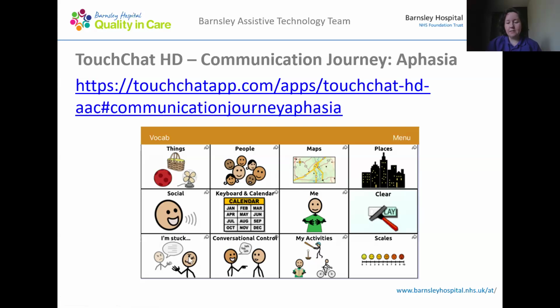And then it goes, is it a person or is it a place, etc. It's designed to help the person get to the bottom of what they're trying to say, a bit like that 20 questions kind of activity. Oh, it's a person, or it's a place, or it's a thing. It's about this person, etc. So trying to help that person get across their message.